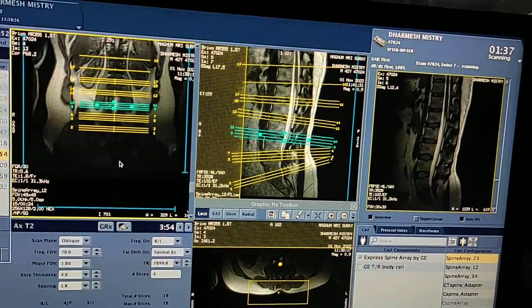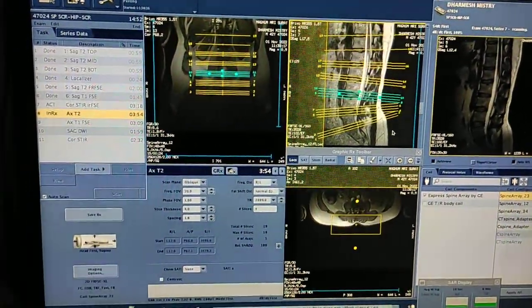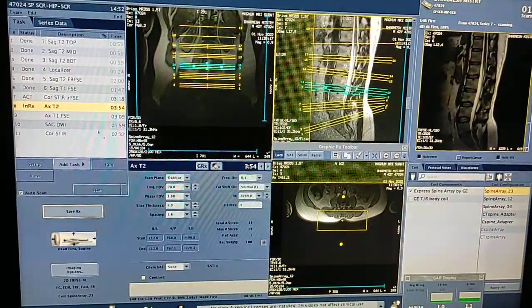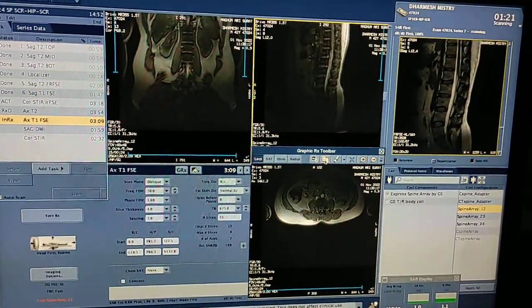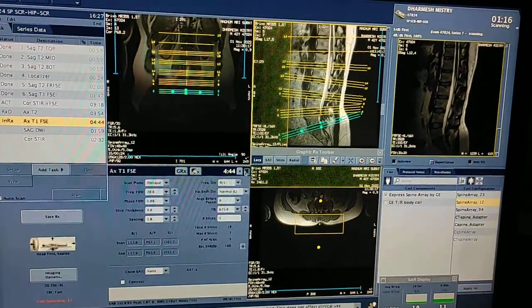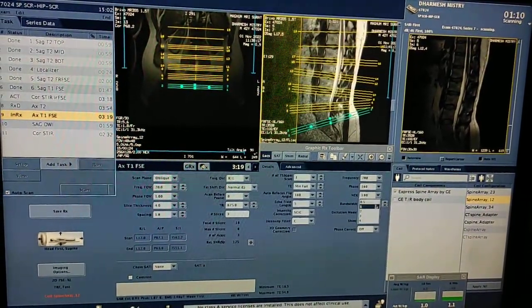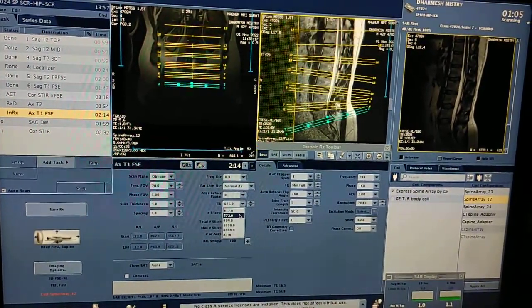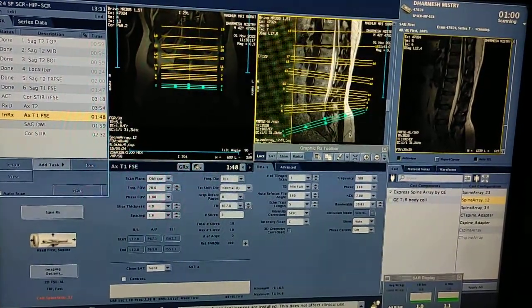Plan the axials properly — Axial T2 first, then Save Rx. Double-click Axial T1, copy the plan from Axial T2, and accept — the same plan has been copied. So the order is: plan Sag T2, copy to Sag T1, plan Coronal STIR, plan Axial T2, then copy Axial T1 from Axial T2.